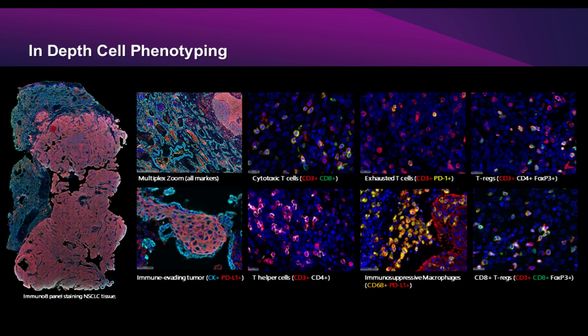Yeah, maybe Scott, you could comment on how much time it typically took your lab to develop a standard 4-plex assay using some other type of chromogenic multiplex or other fluorescent platform? Sure, yeah. I mean, we do chromogenic. Generally, as I mentioned in my presentation, we don't go above too much because then the chromogens can blend and it gets more difficult to deconvolute the signal from one another.